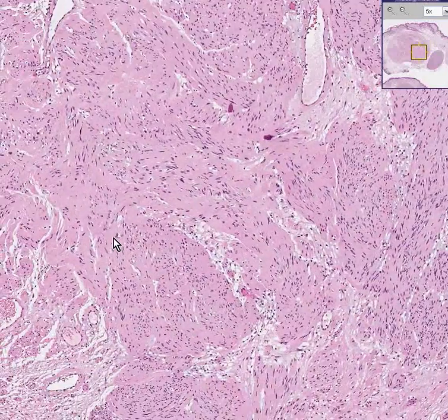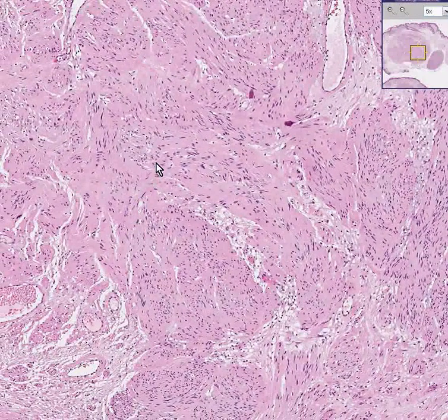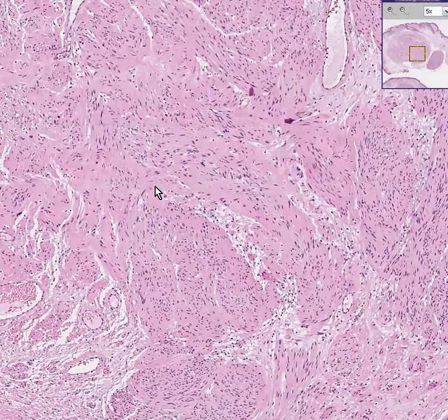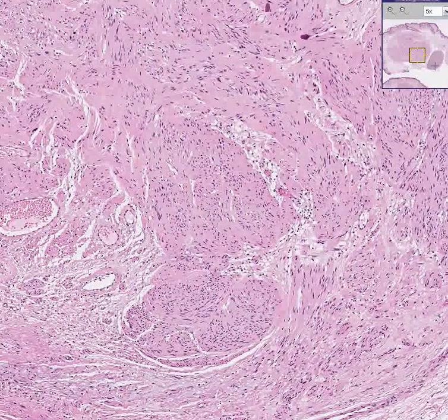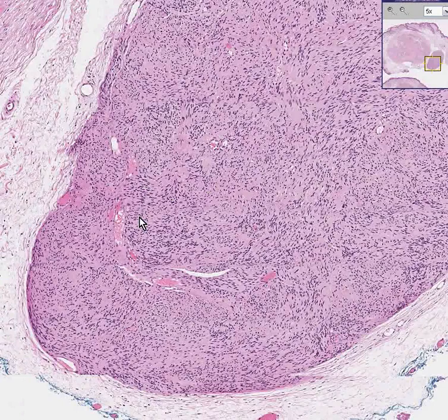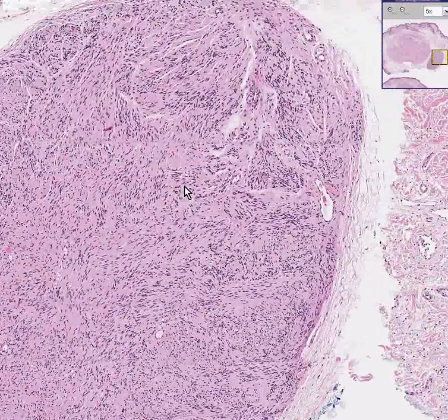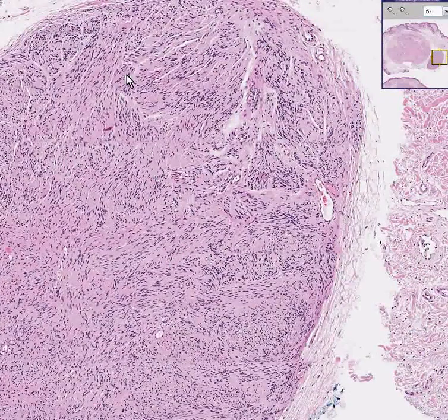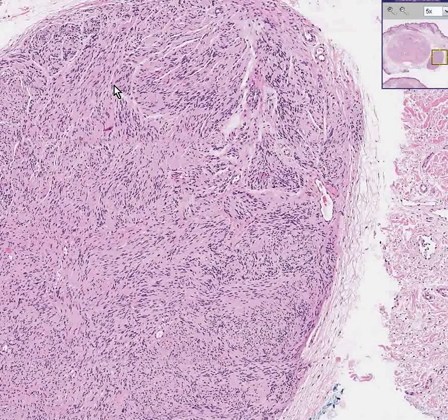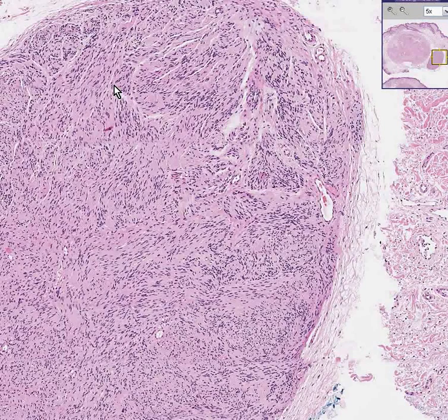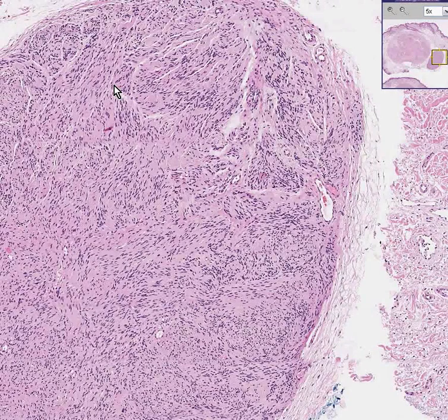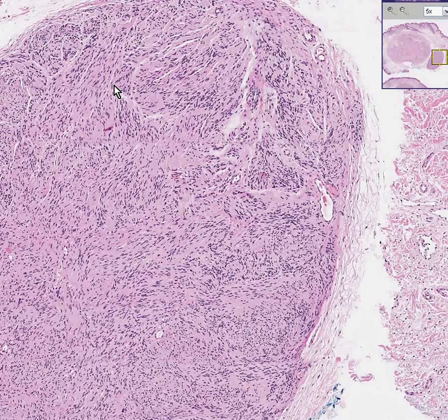Maybe we could start to imagine a little bit of palisading along here. Maybe we could see some palisading along here. This is a benign Schwannoma, or the garden variety tumor of peripheral nerve. This one happens to be primary in the skin and they're benign. And that's all I want to say about this. Thank you very much.